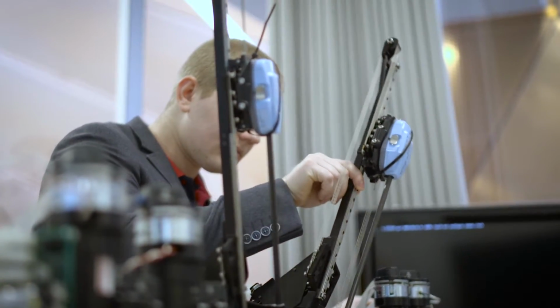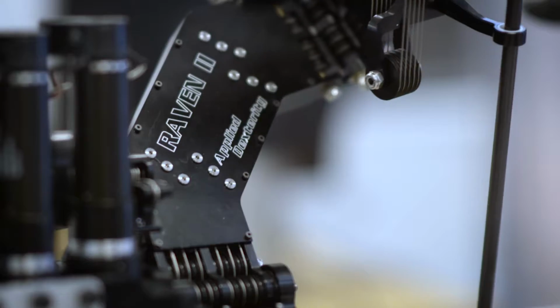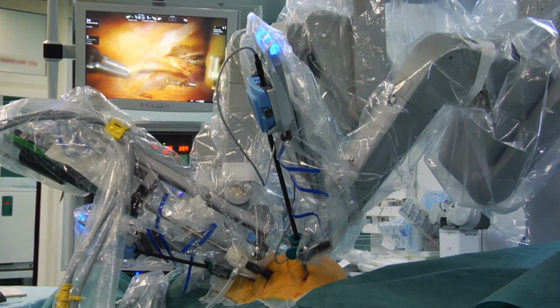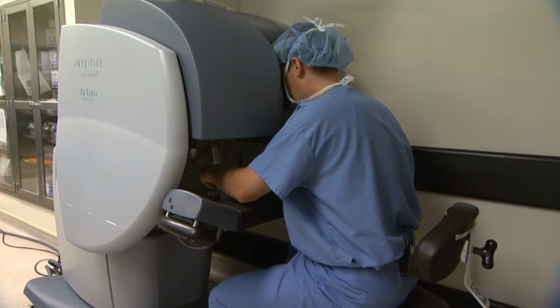We use the Raven robot to develop the surgical action library. This is a research robot where we have full access to both hardware and software. We use the robot in close collaboration with the surgeons at Odense University Hospital. The collaborations with the surgeons are important for us because they are the real experts in the tasks that the robot has to perform.